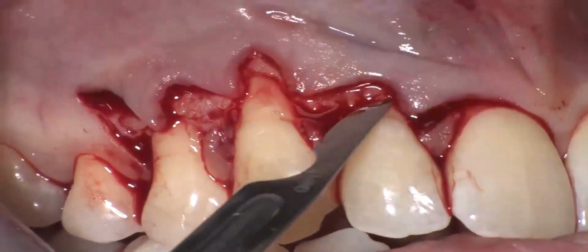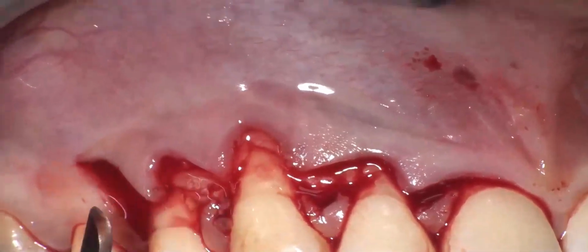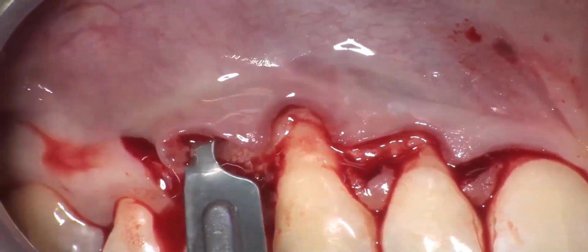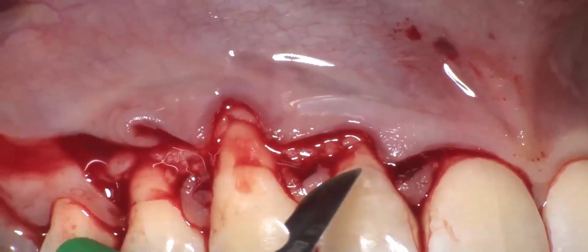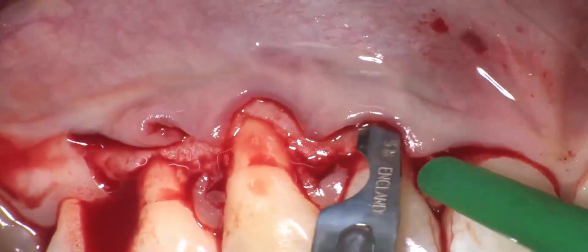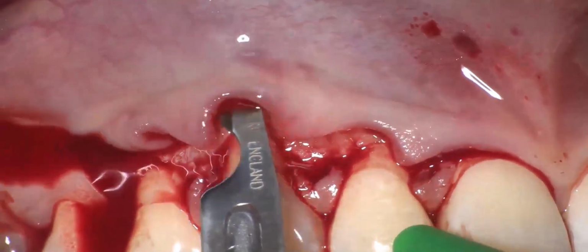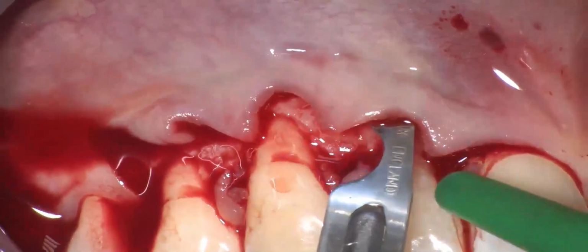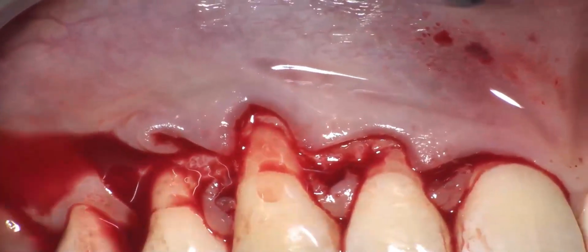So now it's possible to change the inclination, and instead of being parallel to the bone, I start to be parallel to the lining mucosa, and I'm using my blade to detach all muscles. Here there is still to remove the muscle from the bone, and now I can make my blade parallel to the lining mucosa, and this is how it is done. There shouldn't be any interruption in the movement of my blade below the tissue.